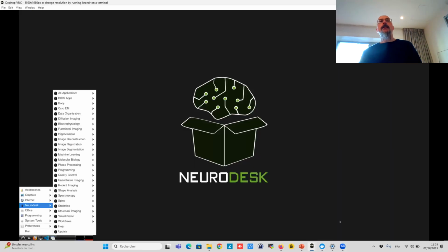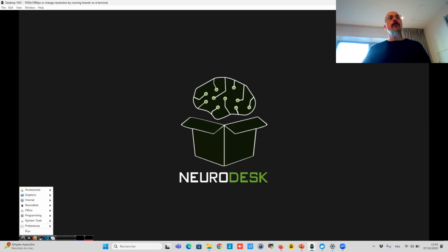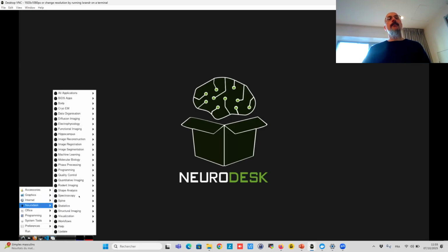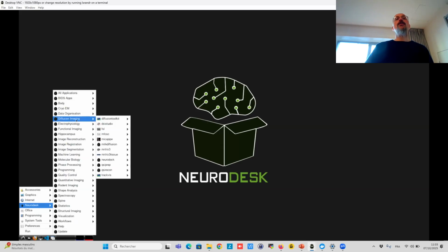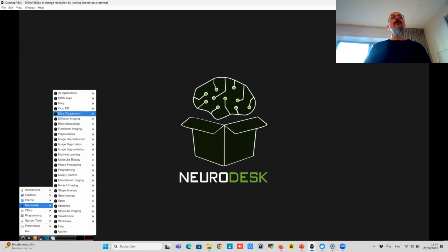Okay, let's go back. As I said, it's a desktop. And if you go there, you will see that you have a bunch of software. If you want to do diffusion imaging, you can use FSL. Some of them I don't know, but there is a bunch of software, like MRtrix. Everything is pre-installed, so you don't need to install anything. For functional, it's the same thing. So it's what we will use.